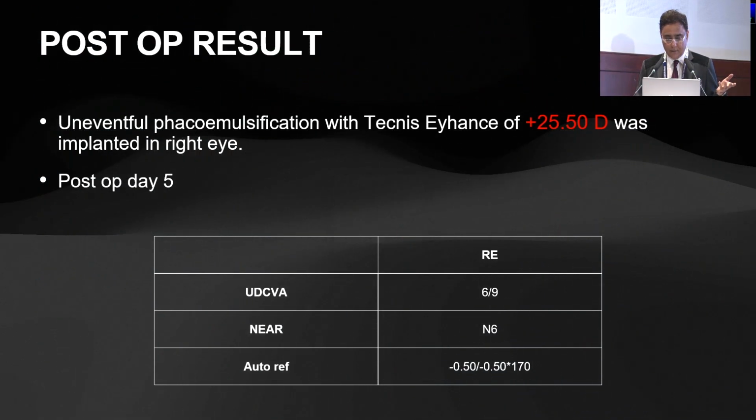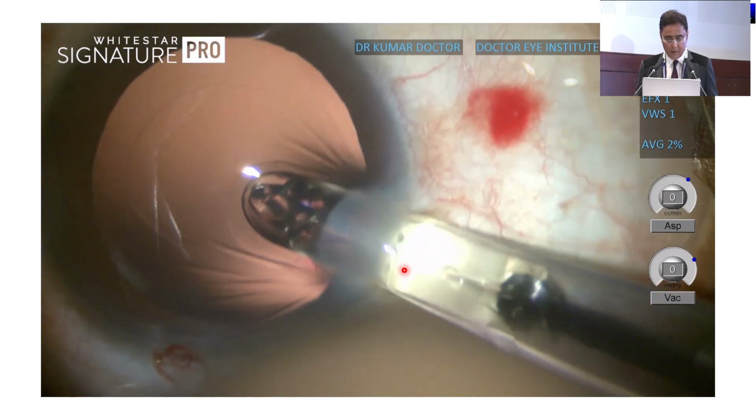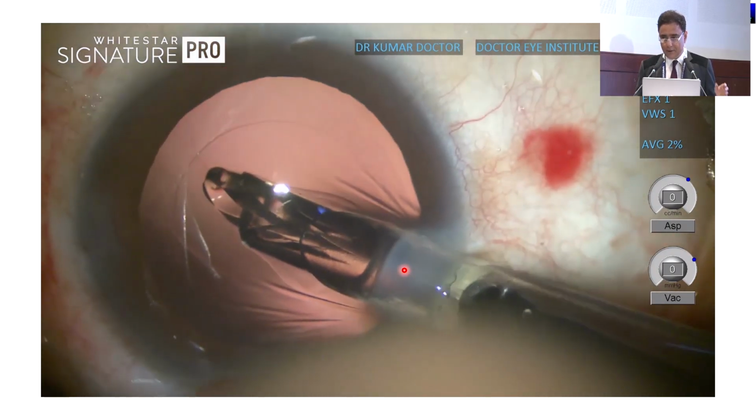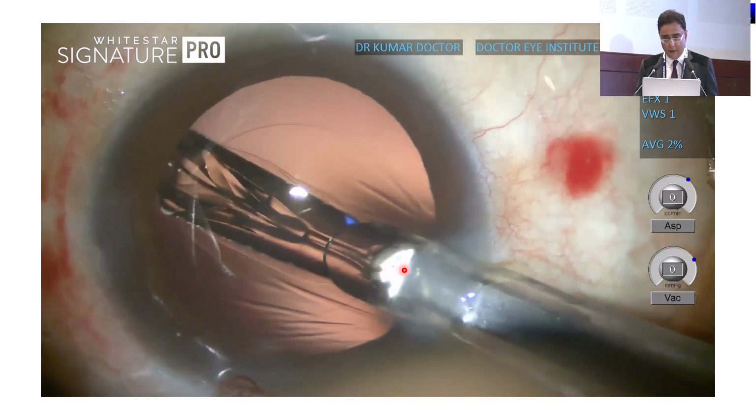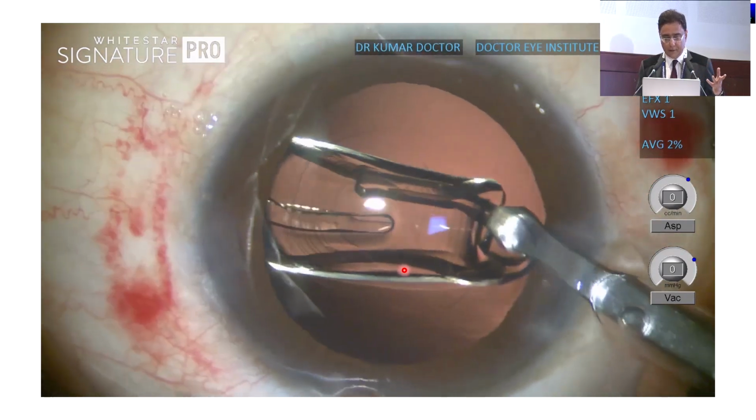Okay, I'll just take a second more. This is just a case where the patient, if this plays, I don't think it's going to play. So that saved, it's going to play. Very good. So this is a femtorexis, again post-refractive, with a trifocal lens going in. The beauty of a femtorexis, controversial.